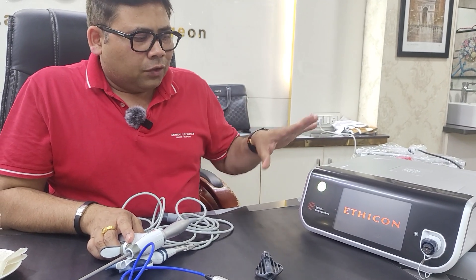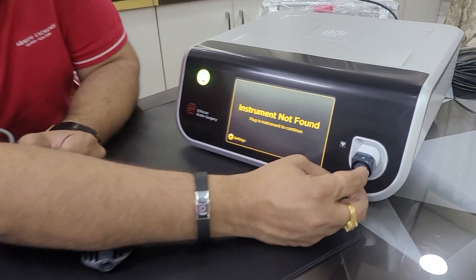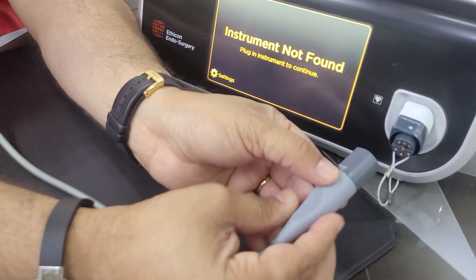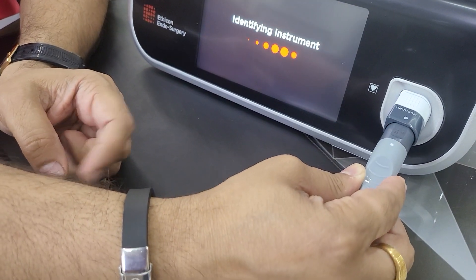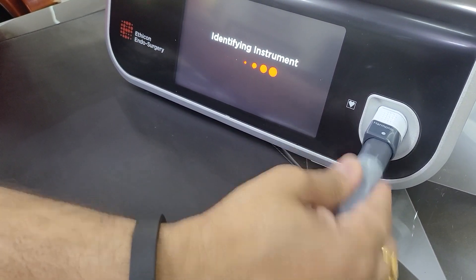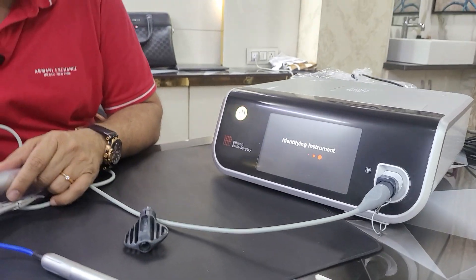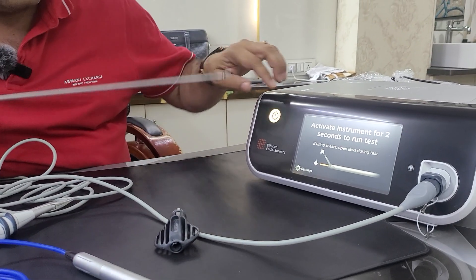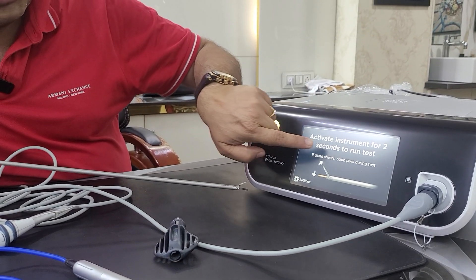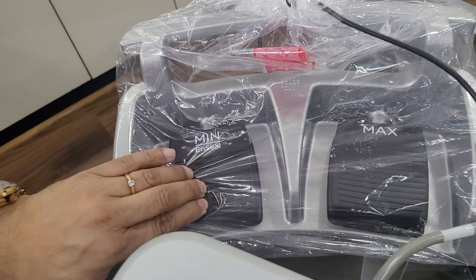Let me tell you how to use this machine. Once you have switched it on, there will be a display showing 'starting up.' You have to wait patiently for the machine to get calibrated. Then, a very important thing is this notch — can you see this notch? This instrument has a white dot, and this white dot should go inside. There will be a click sound. The machine is identifying the instrument, which is very important. Once the instrument has been identified, the machine shows 'activate the instrument.' For that, you can use this foot pedal. Now the machine is active.